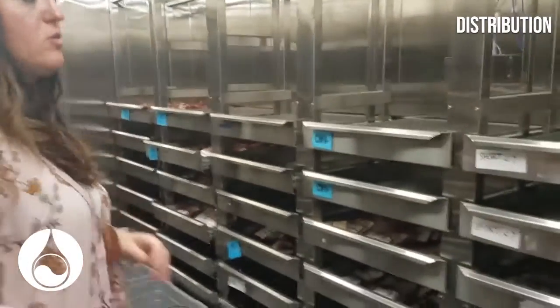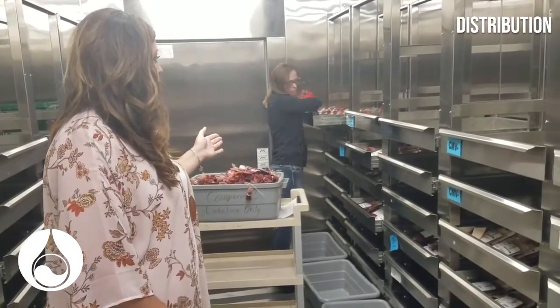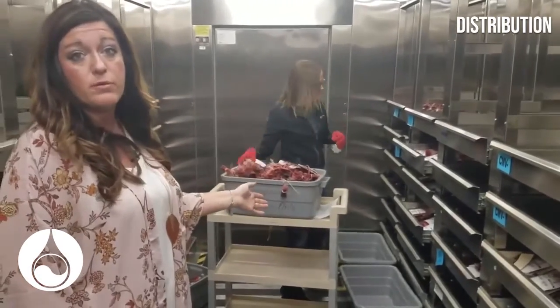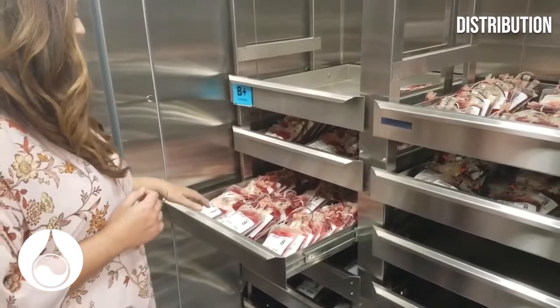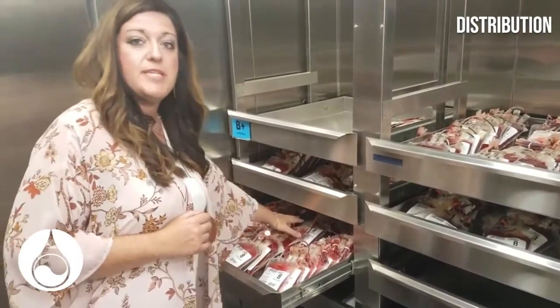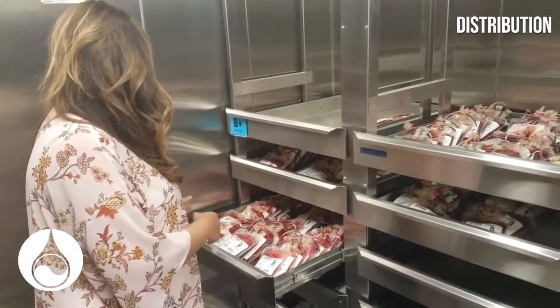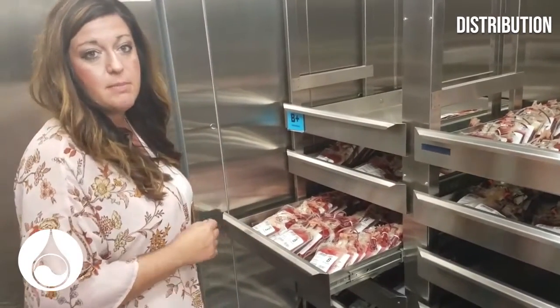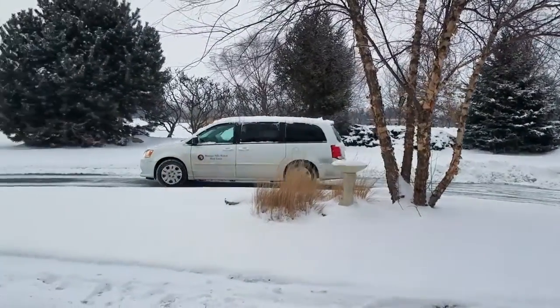This is one storage unit that we have here in Davenport. So right now you're seeing her pulling units that are based off of that Blood Hub order that we talked about earlier. So this is actually how we are storing our units in the refrigerator itself. We usually keep 10 deep and then in 3 rows, and of course it's dating, so we actually pull shortest date to longest date based off of a left to right basis. That's our main goal, is getting those products out the door as quick as possible. Everyone here is here for one reason, and that's to save and help patient lives.